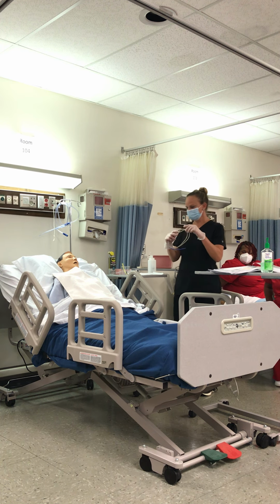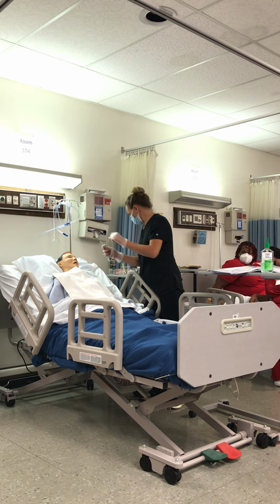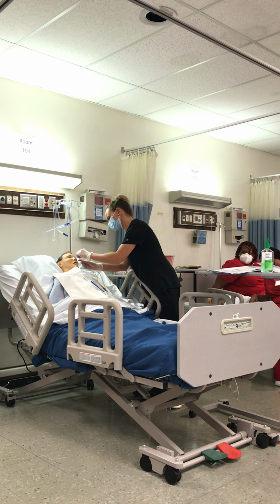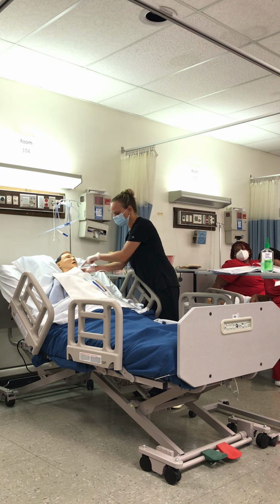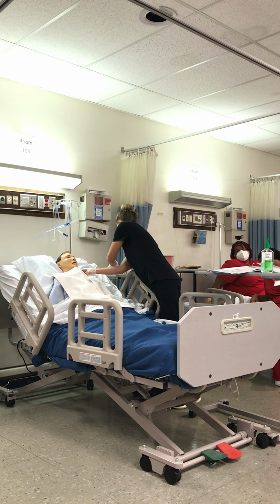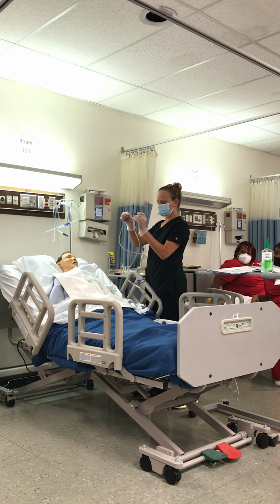Walk me through measuring. Somebody tell me what to do. Tip of the nose, ear, earlobe. Mhm. Tip of the nose to the earlobe. Where's next? Xiphoid process. Okay, so I can let go here, right? I'm going to hold here, and then I'm going to feel for my xiphoid process here. So what do I want to do with the ear though? Mark it. We don't want to mark our patient though, right? So I'm going to mark it here, and then I'm going to mark it here. Okay.